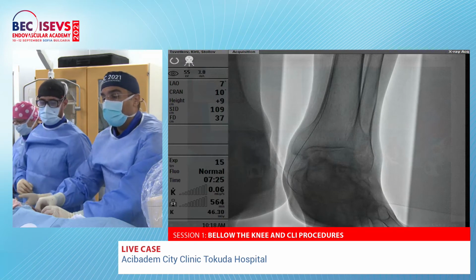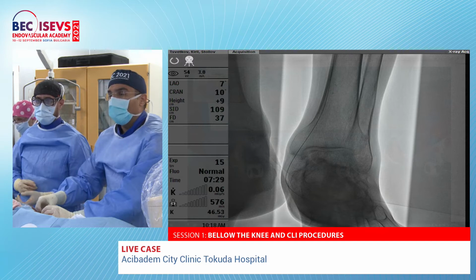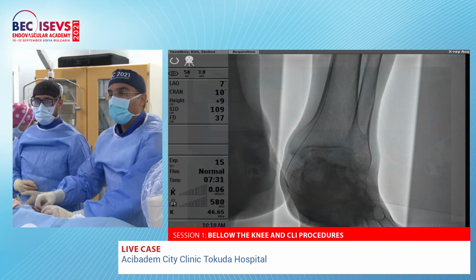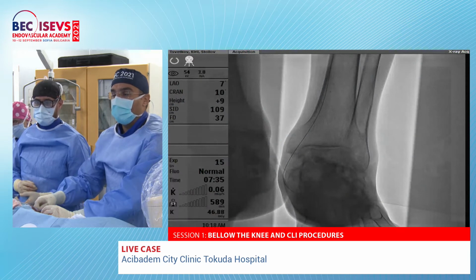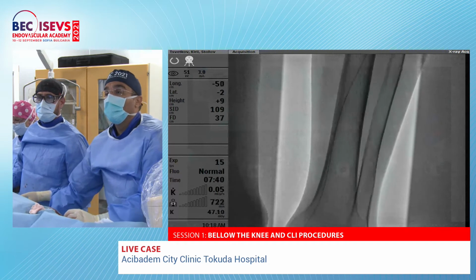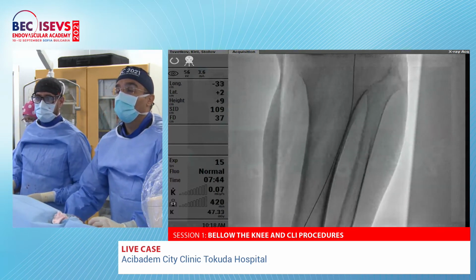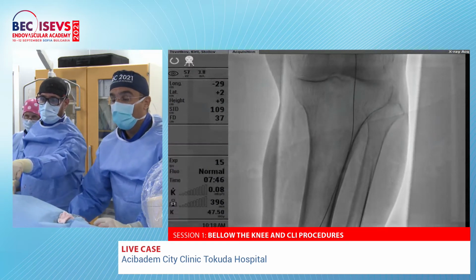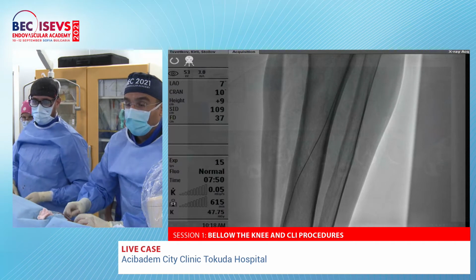But do we have a Command 14? Yes, we do. Do you have 2 millimeter balloon catheters? We have 2 millimeter balloon catheters, and they cannot go through. Let's see where we are now. We're down here, on the right, the tibia.